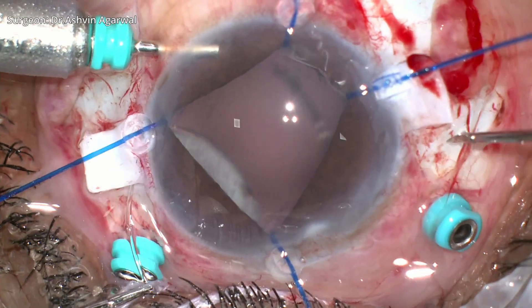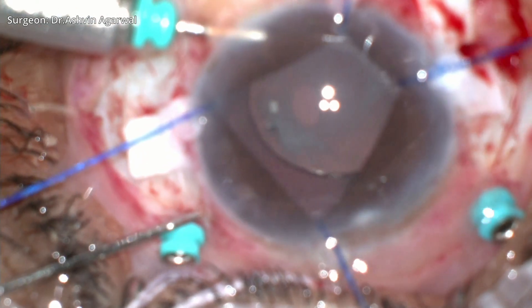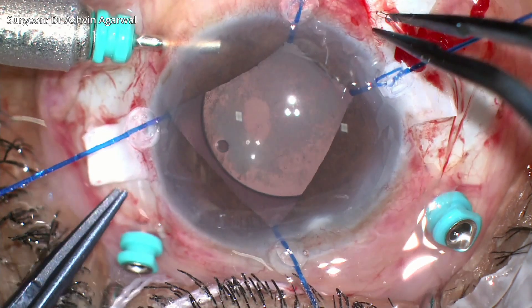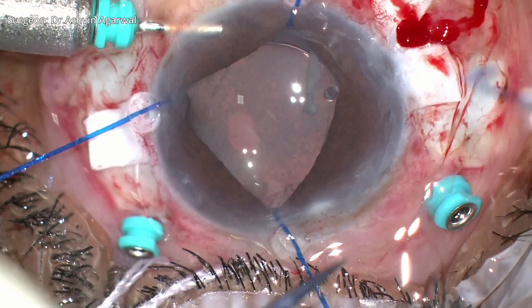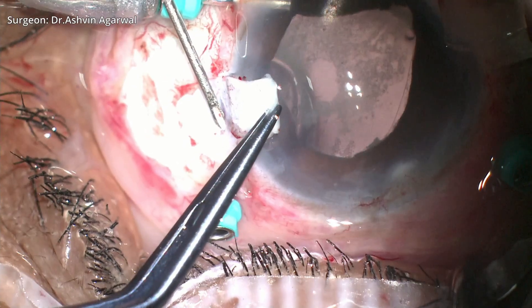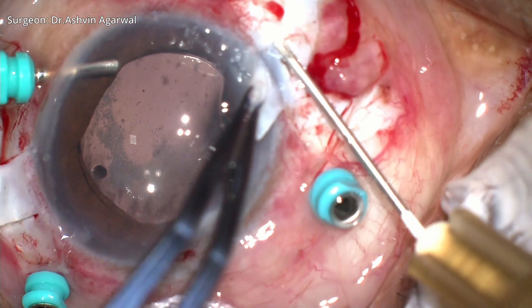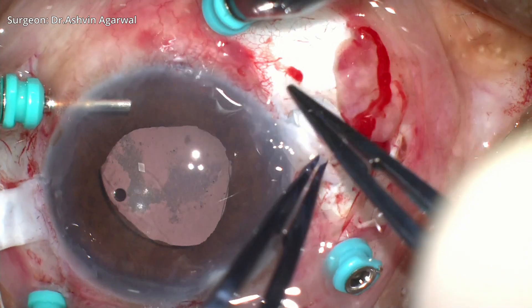Once the IOL is in the pupillary plane, we use glued IOL forceps going through the sclerotomy to grab the haptic and externalize them on either side. After stabilizing the haptics with a silicone plug, a 26-gauge needle is used to create a Scharioth pocket through which the haptic is tucked and secured. The same is then done on the other side.